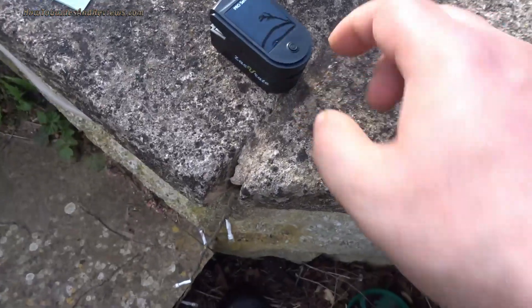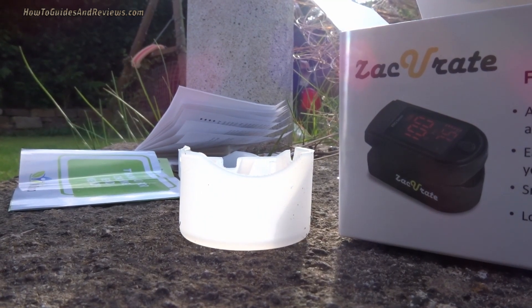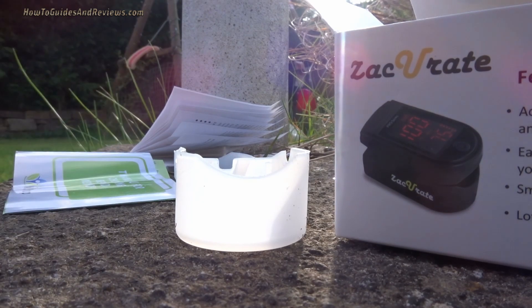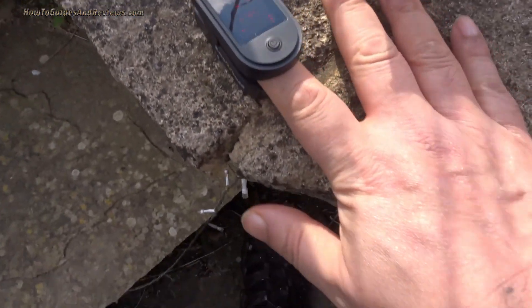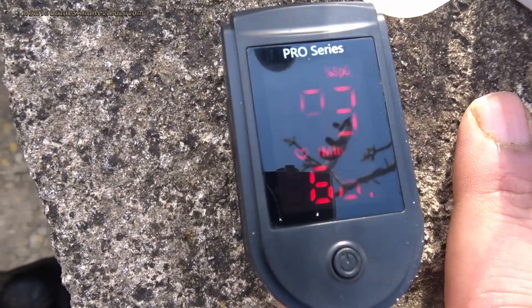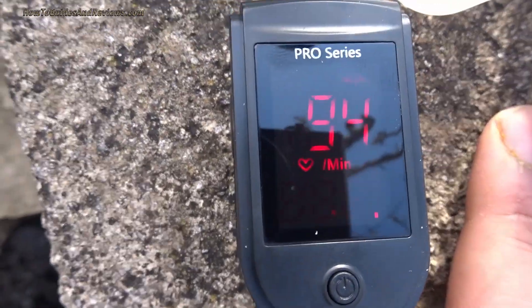The battery is in. Let's use it for the first time — put the finger in, switch it on, and let's see what happens. Keep it stationary. It's reading 93... 94. That's a bit low, isn't it?